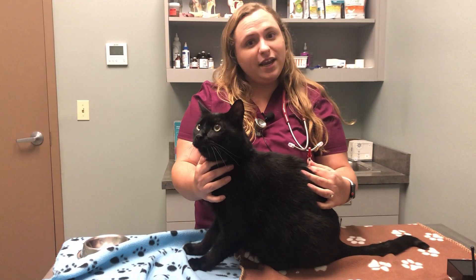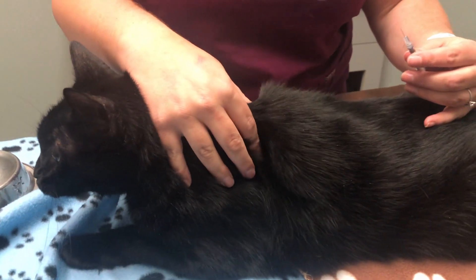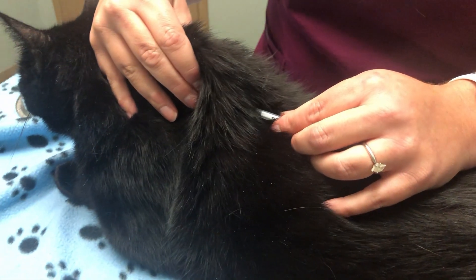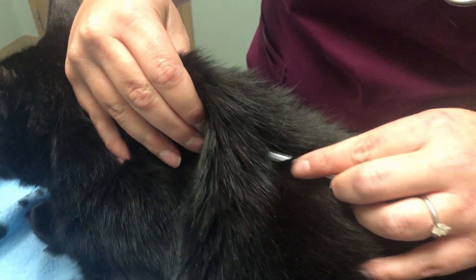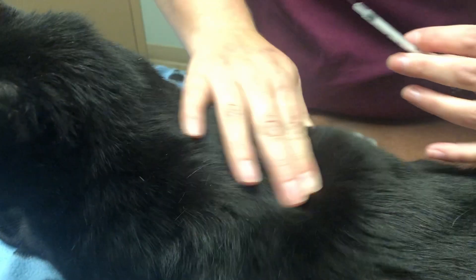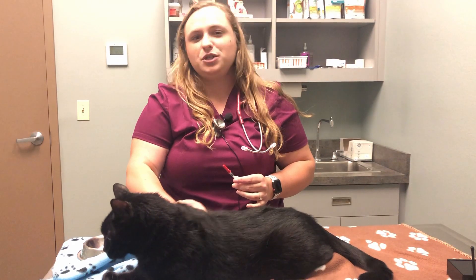Pull a little bit past the labeled dosage and then push it back up to the labeled dosage. Then you take your kitty or dog, grab the back of their neck, tent the skin, place your syringe parallel to the spine, insert the needle, pull back a tiny bit just to make sure you're not pulling back blood, and inject the insulin. Then take the needle out and rub the spot to make sure it's not too painful.